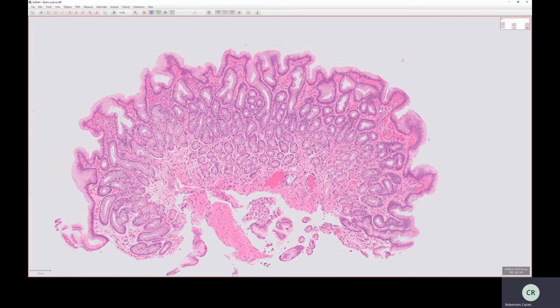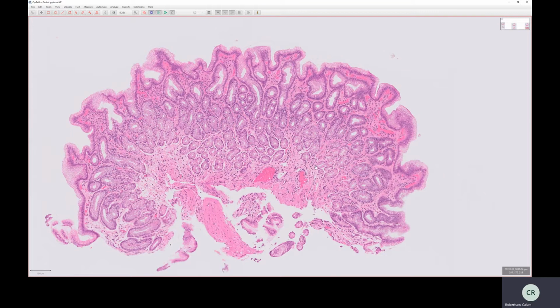There's really very little to say. This will follow the same basic structure as the rest of the GI tract. So we've got surface epithelium, lamina propria between these crypts, muscularis mucosae below that, which has been transected while taking this biopsy. So the very lower extent of it is actually through the muscularis mucosae. So we've got little fragments of it here. And there will be gastrin secreting neuroendocrine cells probably among all this, but I can't identify them. And so it's basically just mucus secreting cells. It's quite an unexciting biopsy. Not entirely normal, I think.